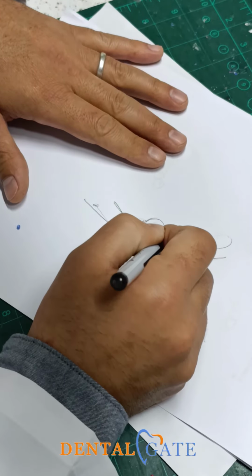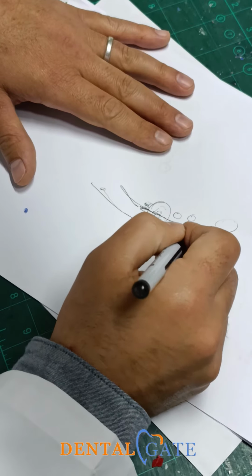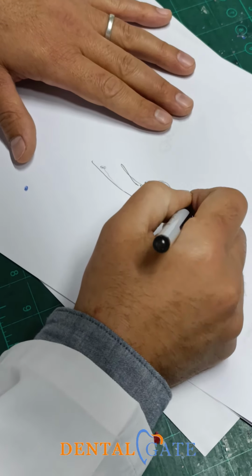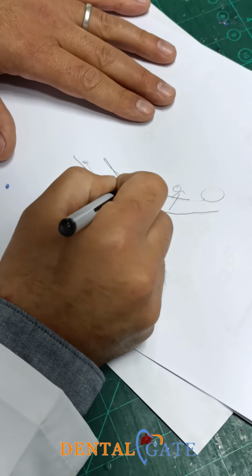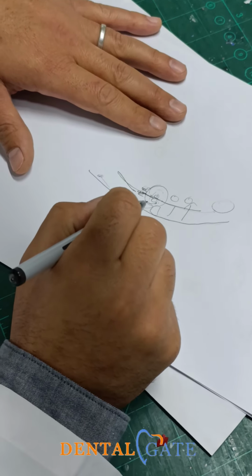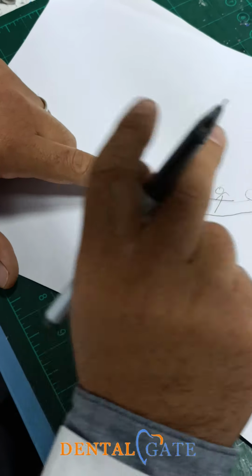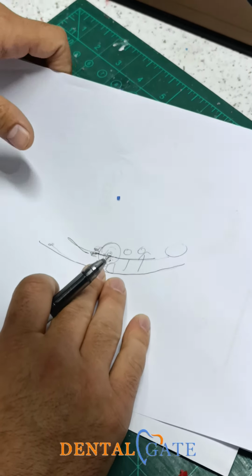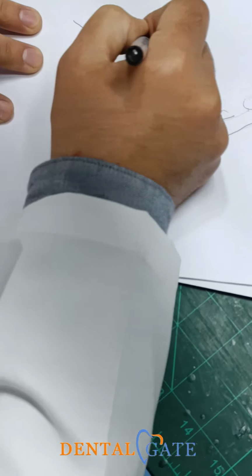Okay? After that, when I put my 6 here and my 7 here, the 6 of the lower should follow the upper. The 7 should follow the upper one. The upper should follow the 2 premolars of the lowers, 4 and 5. Okay? So this is the neutral one in this curve. Why will I make it so that 2 cusps touch the table? And the first premolar, the lingual cusp shouldn't touch the table. I will repeat it. This is the curve.